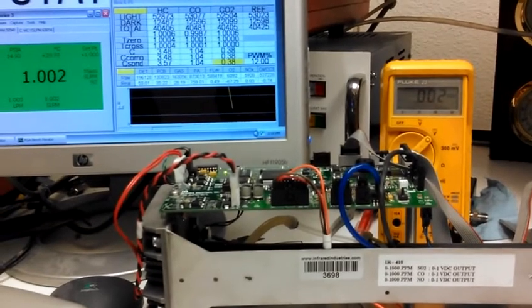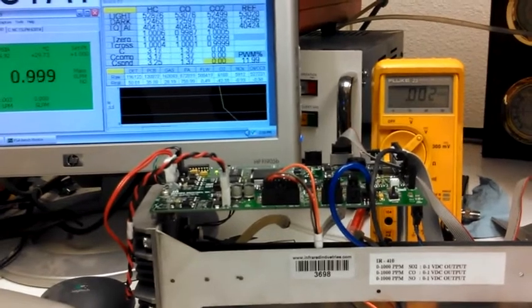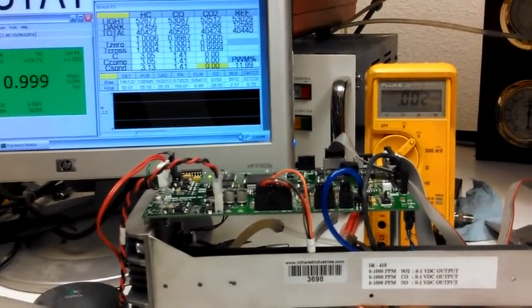Full range up and down, and you've got analog out — so the optical bench was working.